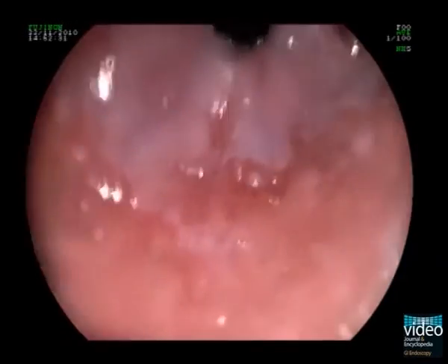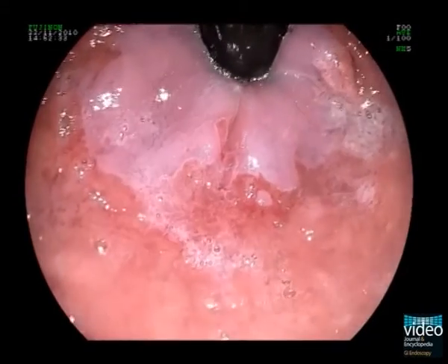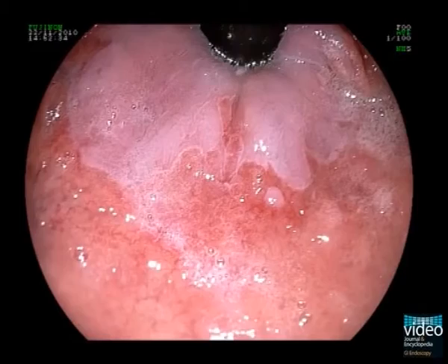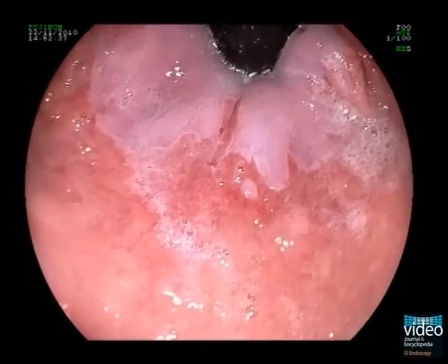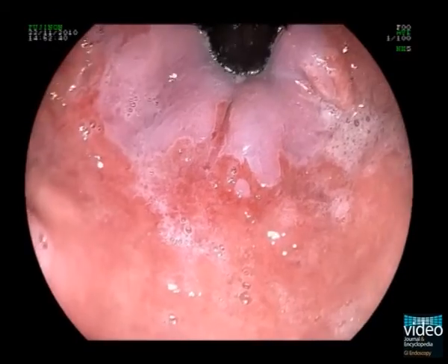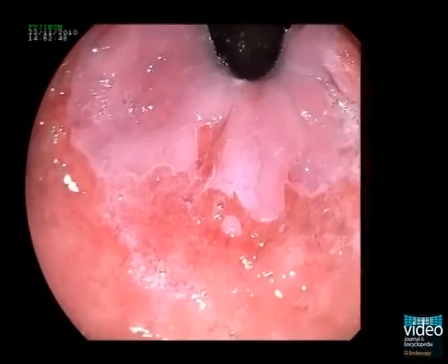After spraying with 1.5% acetic acid solution, the mucosal surface can be better visualized. In the center of the lesion, a subtle irregularity of the mucosal surface pattern can be seen.